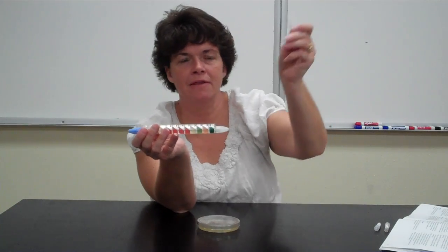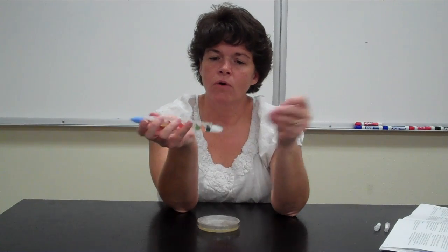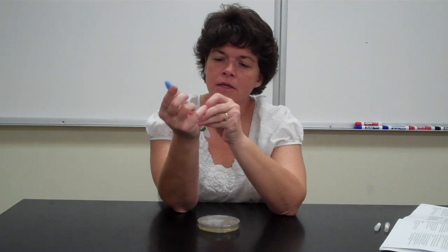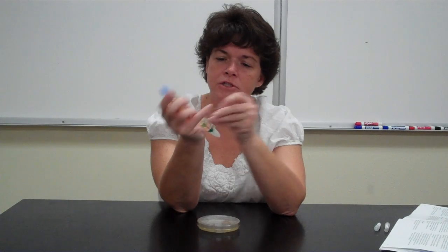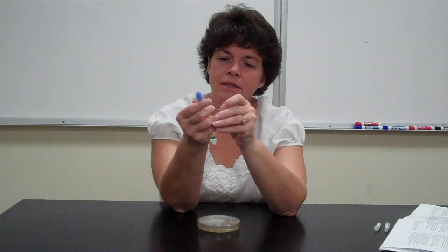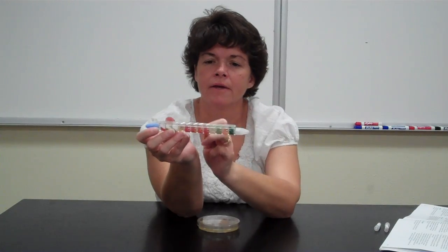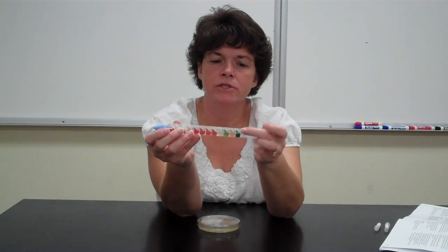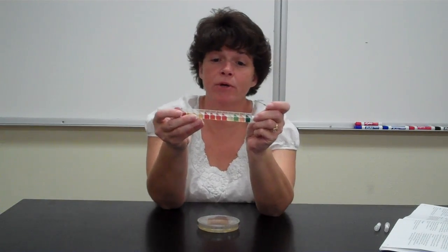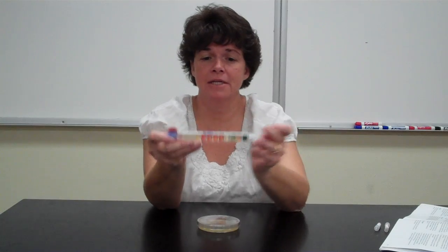What you want to do is take that part that you had just broken off, and pierce a hole in that notch on each one. Essentially what you're doing is exposing these parts to oxygen. Remember, like with the fermentation test and the urea test, we didn't tighten the lids all the way because we want them to get a little bit of oxygen. So I've pierced the side from the red compartment here all the way to the green one here. Now you wouldn't be doing all this because you'd have bacteria and you'd be moving a little bit quicker than me. Do not pierce the part that has the plastic on the flat side.